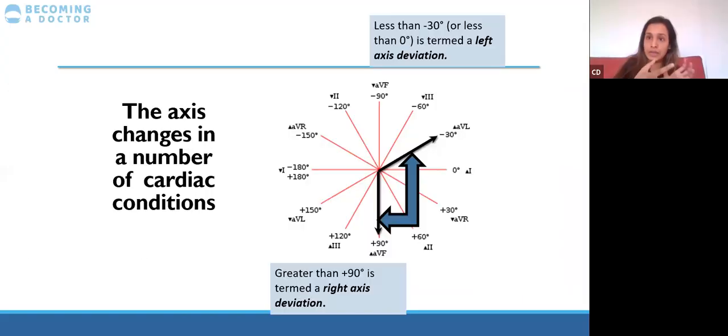A little bit to the left. So you get a slight left axis deviation when you lie down, and when you stand back up, it moves slightly back to the right, so you get slight right axis deviation when you stand up. And it also can change physiologically in inspiration and expiration for similar reasons, just with the lungs moving the heart.